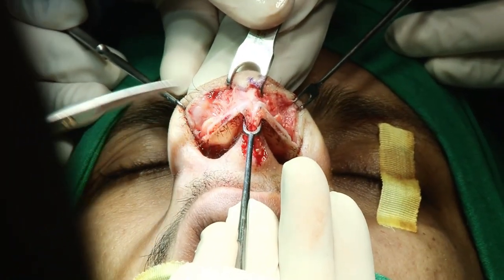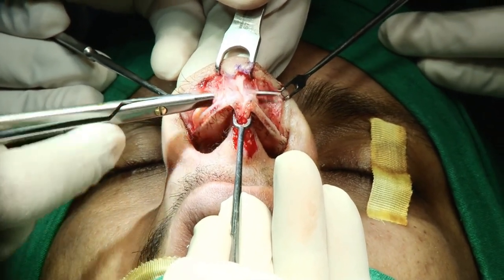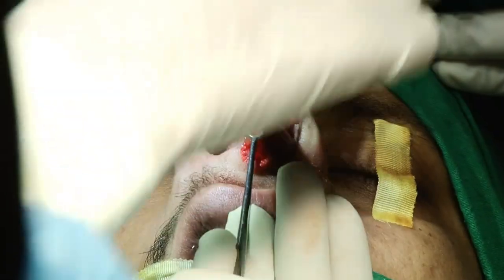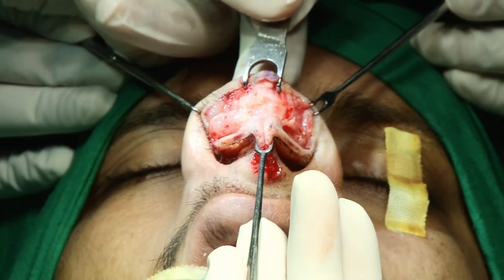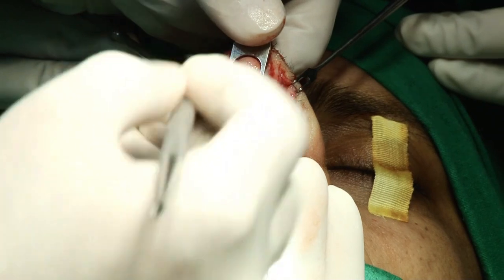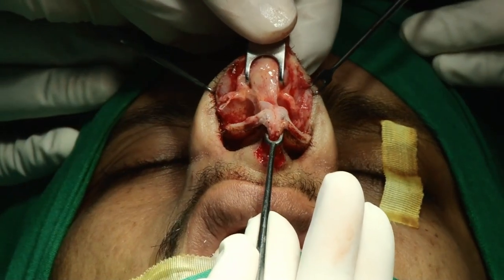Then this is your dermocartilaginous ligament. So you cut it like this, and then now again you change, because look, we identify that we find the net-like structure. So I change the position of my instrument, then the things are changed. Now look, the things have changed. If you are in the right plane, there is no bleeding. So then we cut it.